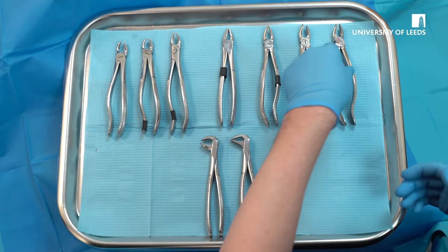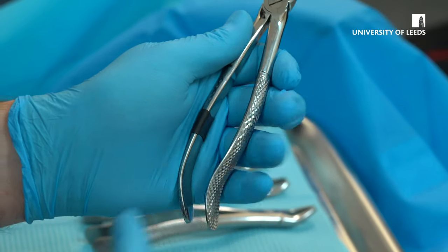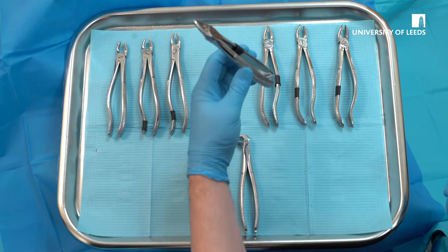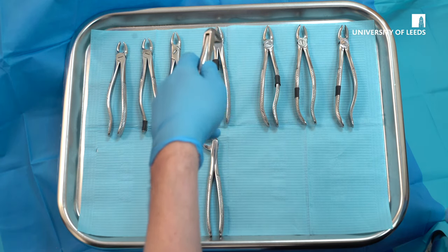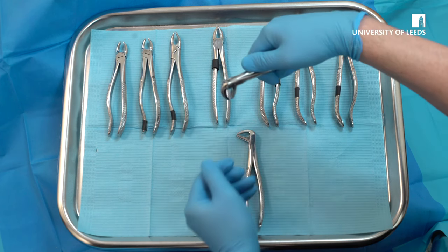As opposed to these three, where a left-handed operator would hold them like this, with the curve with the fingers. These forceps are universal and can be used by either a right-handed or left-handed operator. These forceps also, for lower extractions, can be used for a right-handed or a left-handed operator.